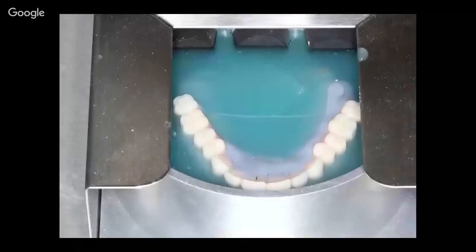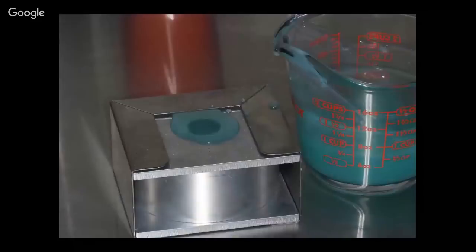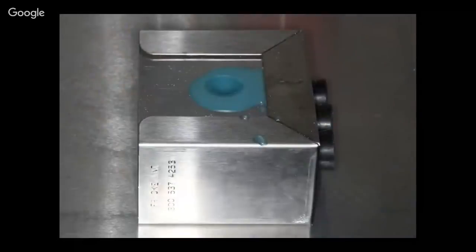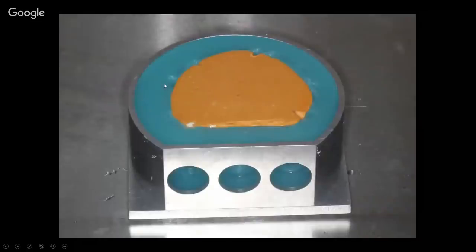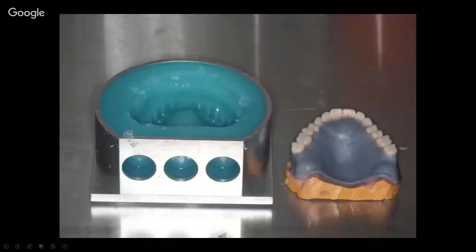And so once you've done this, you've filled it up to completion, you've overfilled it, then you'll just set this aside and allow that agar to cool down until it's solid. Okay, so this is not as fast of a technique as printing necessarily, but it's still very efficient. All right, so my agar is cooled down, everything is solidified, and now I can disassemble the flask. I can remove the bungs right here. I can now take a little knife and tease out my master model. All right, so tease out the model, and that leaves you this.